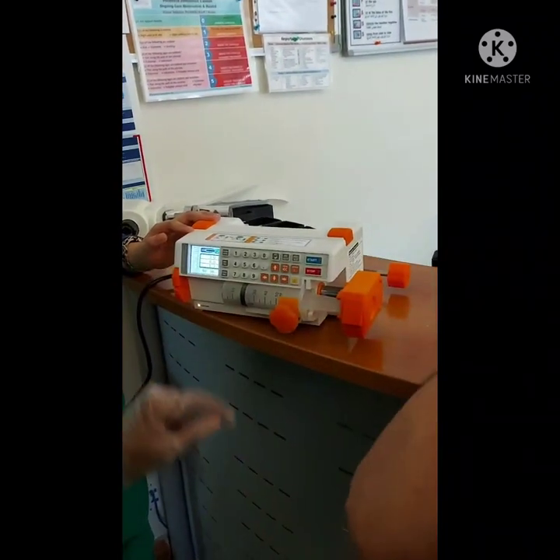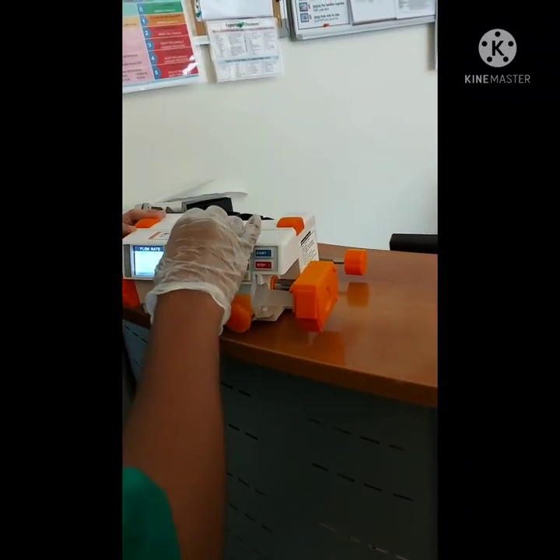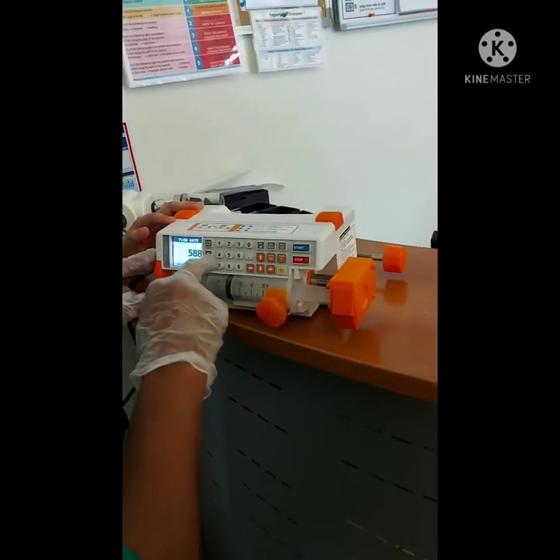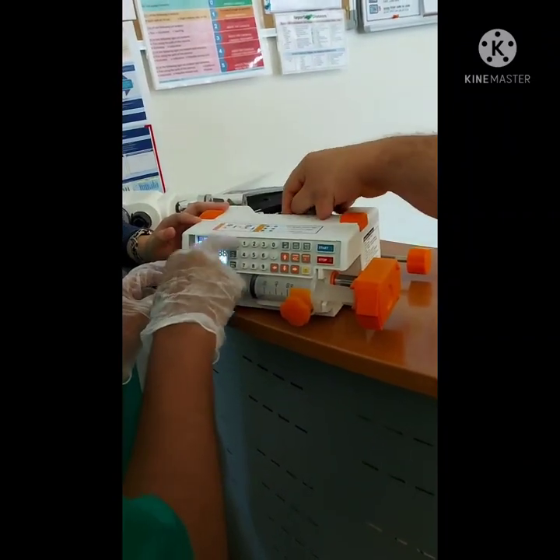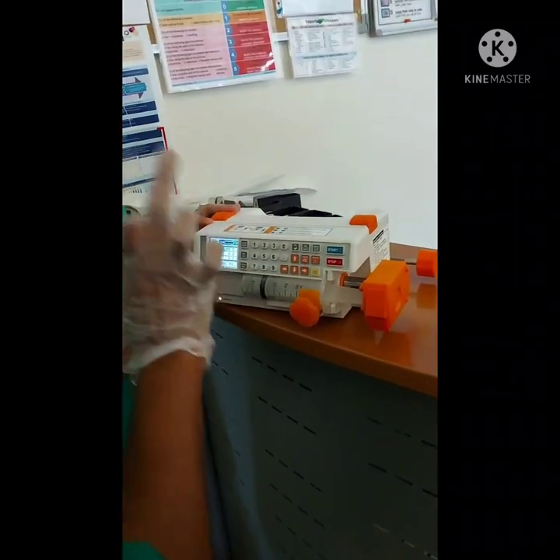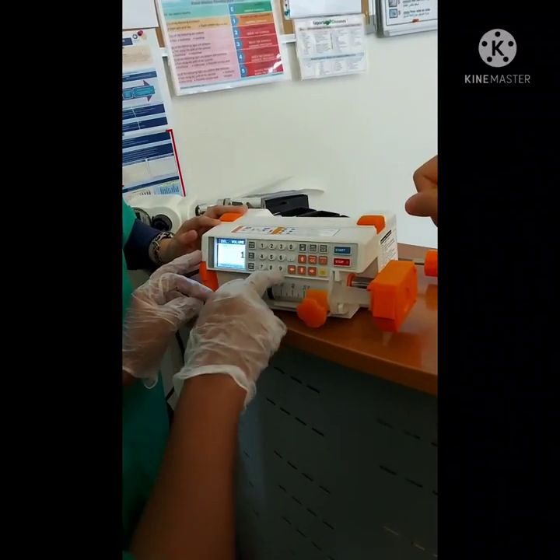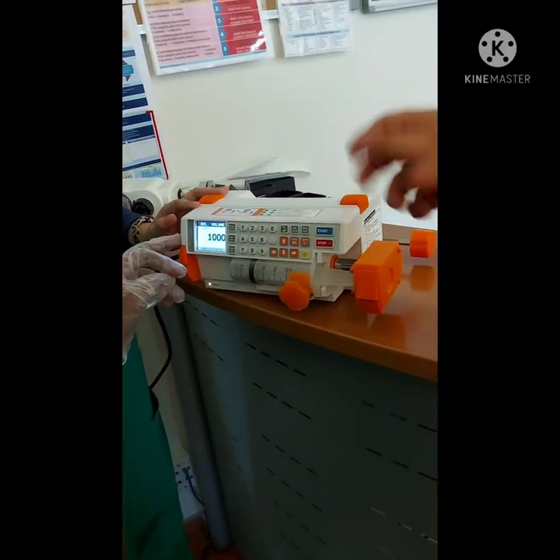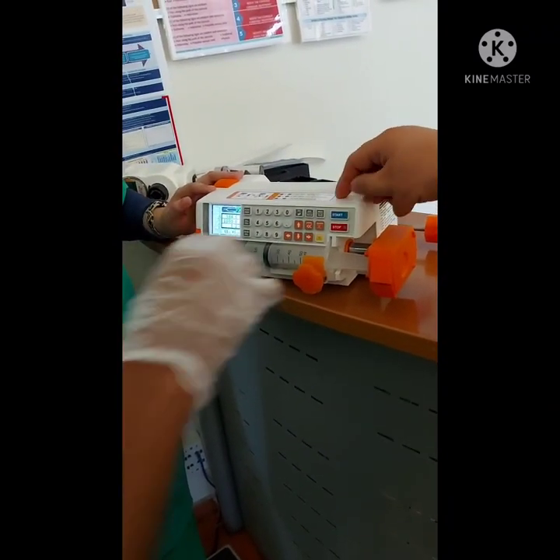Okay, then we can regulate 500 ml. Then we start the flow again. It's now written. Then it's written again. Okay. Now we're ready to start. You can start.